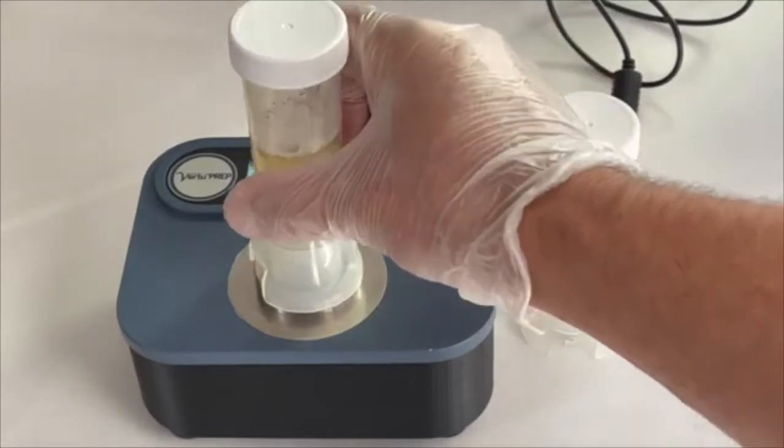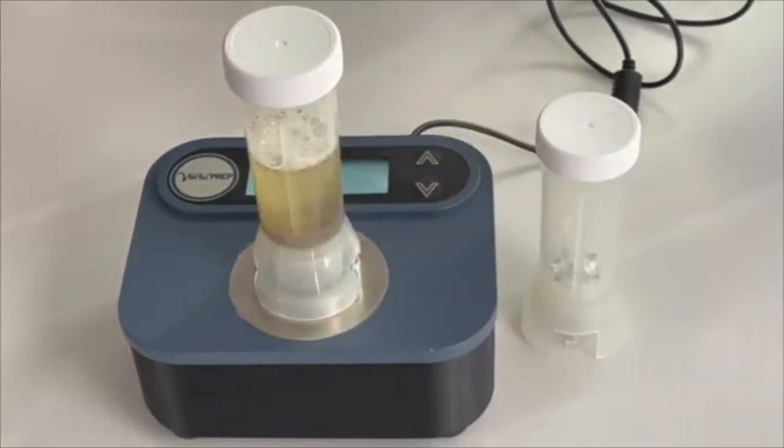Measure the sample and extraction solution into the Virtu Prep tube and seal tightly with a cover. Twist to lock it on to the mixer. The mixer will start and stop automatically.